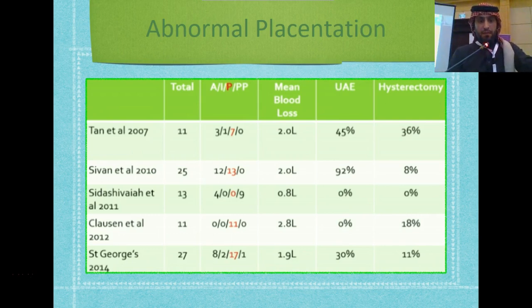A few studies show the blood loss is less, and it shows more effectiveness: if you are using balloon occlusion, the rate of hysterectomy is less.